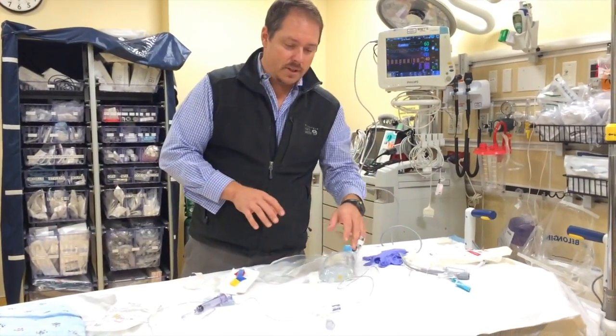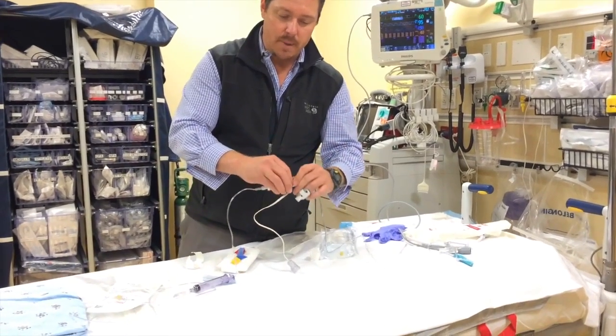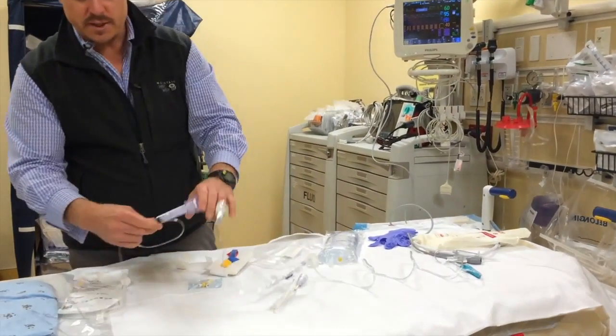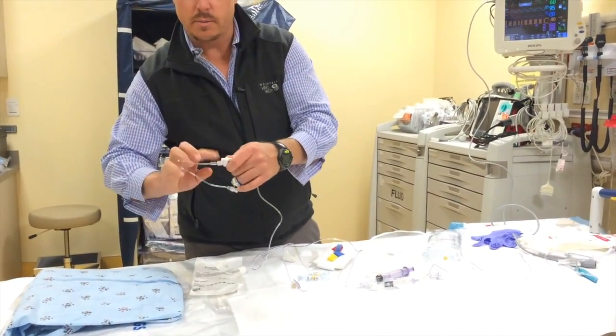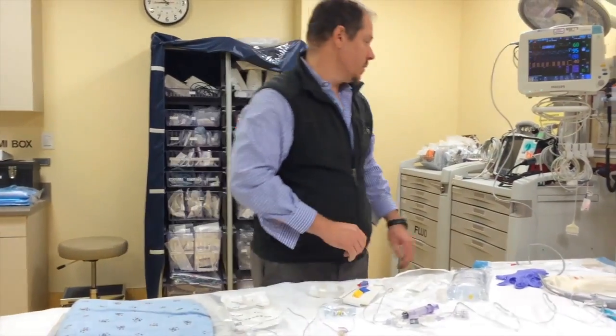Before I even start priming this line, I like to set this up with gloves on and check all of my connections. Inevitably, one of these is going to be loose — they seem to always come loose after having been sterilized. You want to work your way all the way down the line and check every connection. Having one of those fail during a procedure would be problematic.